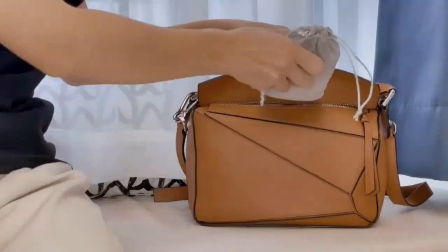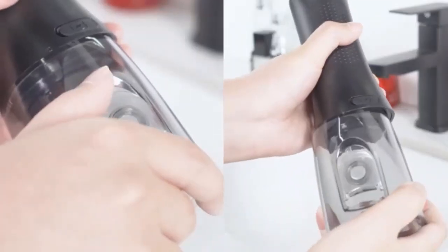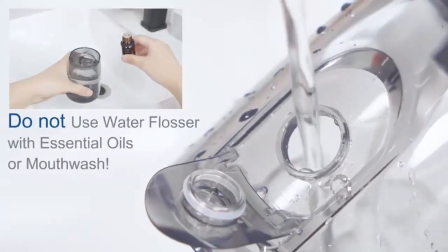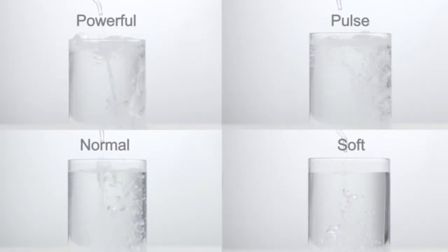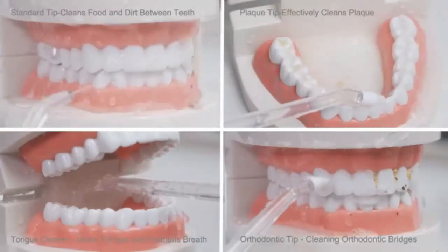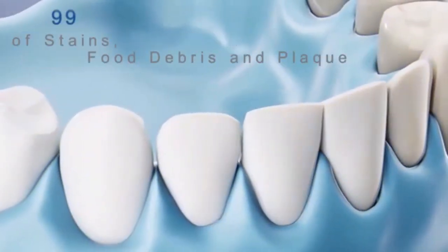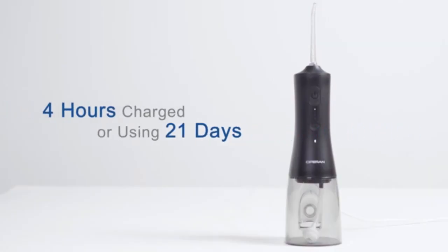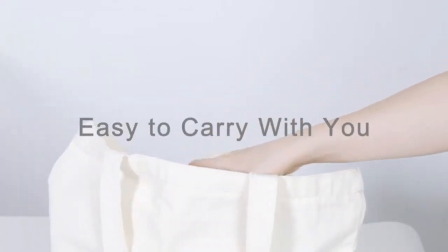Elevate your oral hygiene with the Mosell Water Dental Flosser — the ultimate oral care solution for home and travel. With a 350ml water tank and an easy-to-read display, it offers a powerful and efficient clean every time. Choose from five pressure modes to suit your dental needs, from gentle to deep cleaning. Equipped with eight replaceable jet tips, this flosser is perfect for the whole family. Its portable design and included storage bag make it convenient to take on the go.